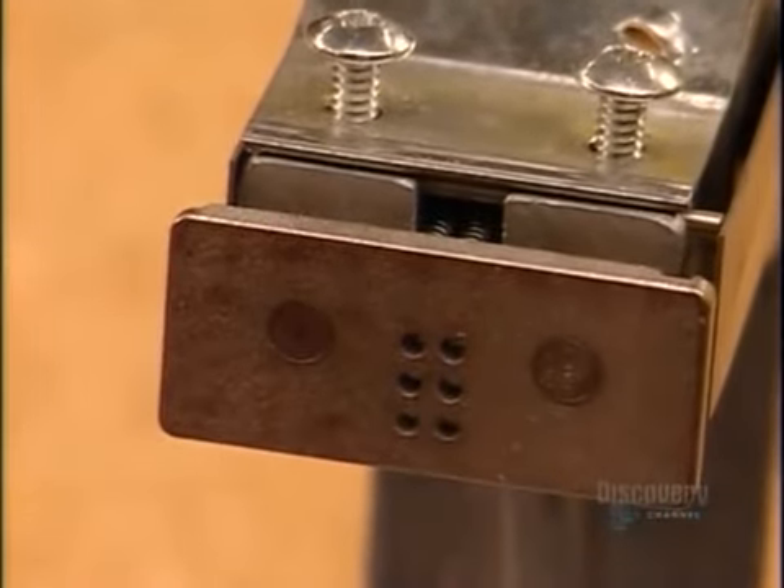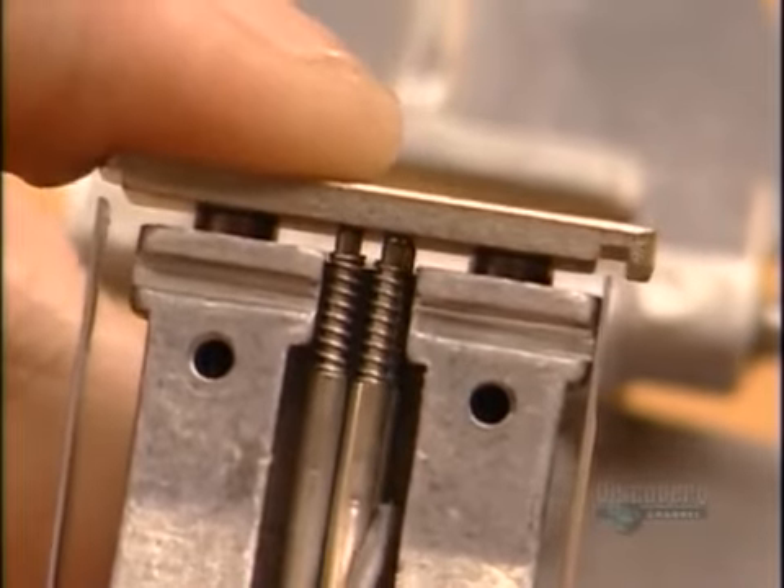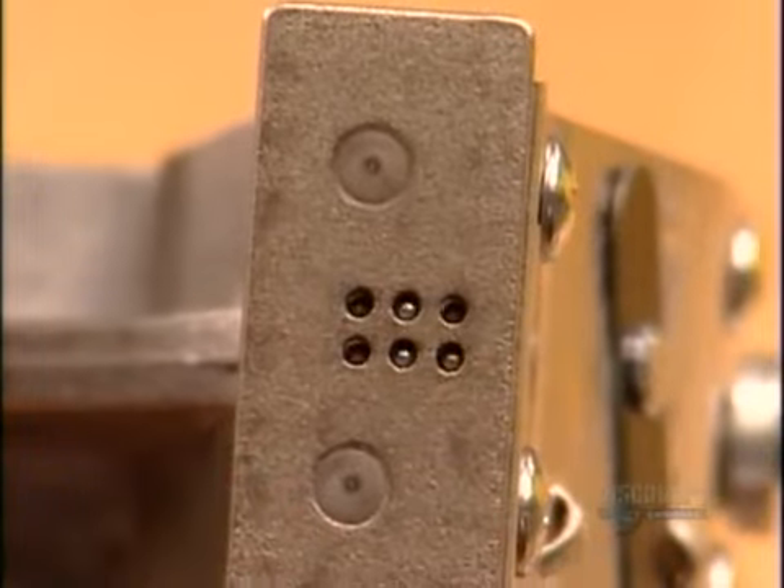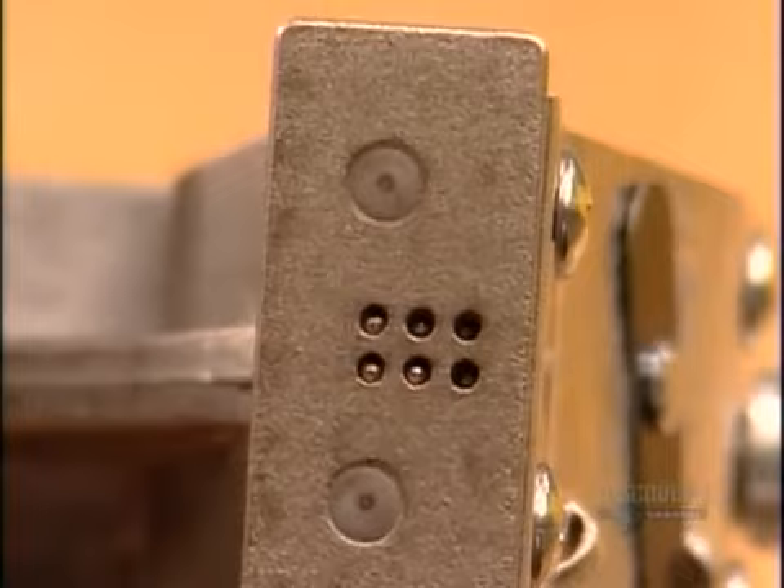The stripper plate has six holes in the configuration of the Braille cell. When you press a key, the corresponding stylus protrudes and strikes the paper against a dot-shaped die, creating a raised dot.